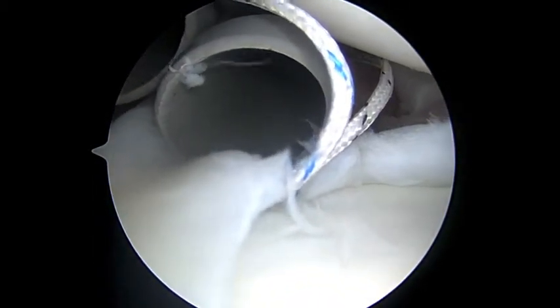Here we're looking from the front again. I just wanted to show you how we smoothed out that labrum without having to place an anchor, while maintaining good fixation on our biceps anchor — so that's solidly fixed. Now that labrum looks more like a normal labrum without anything that can catch, pinch, or click in the joint. We're going to finish up here and get you back to the recovery room shortly. I really hope this does the trick for you. Good luck.